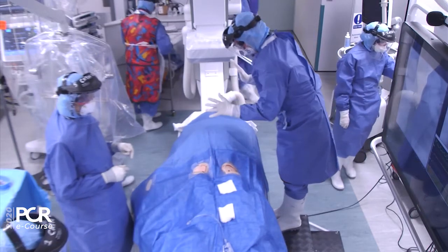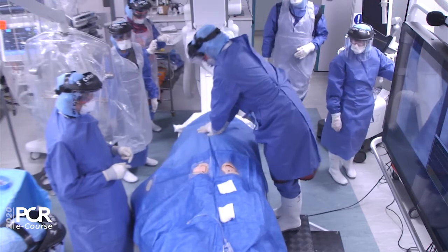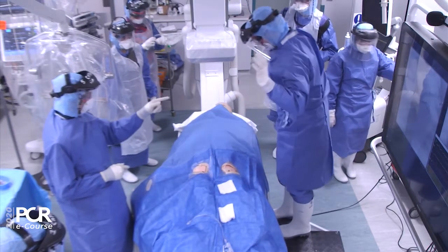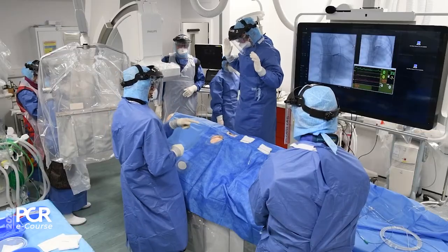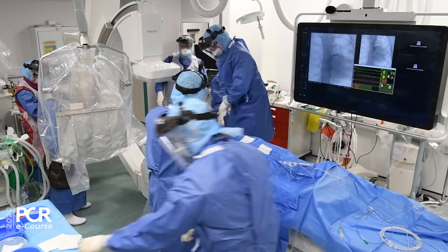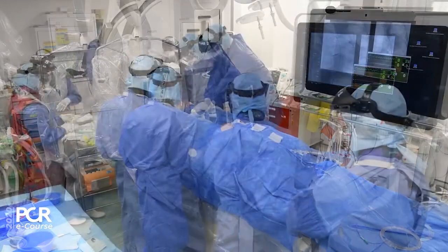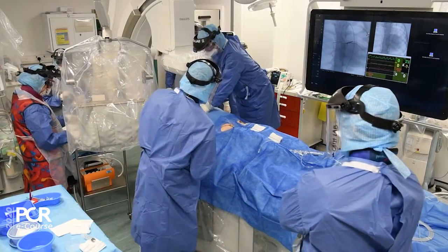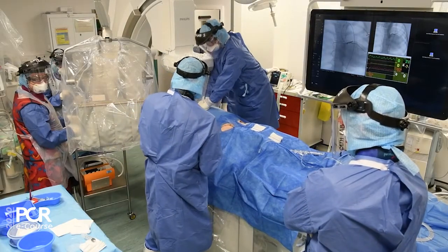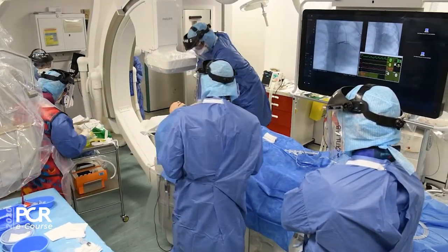Okay, has it been 2 minutes? 2 minutes over. Okay, check the rhythm. There's still VF. Shock, please. Okay, charging. Oxygen away. Shock. Okay, give the adrenaline. Get the camera out of the way so they can intubate. Adrenaline going in. 1 milligram adrenaline. Let's get the C-arm away. Keep on with the CPR. Adrenaline is in.